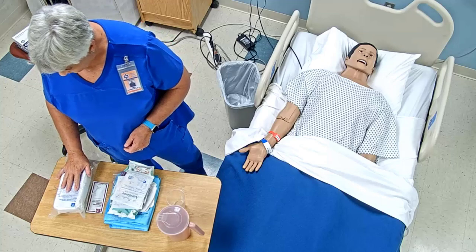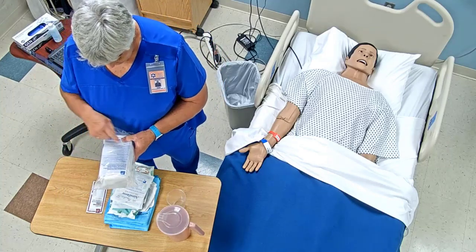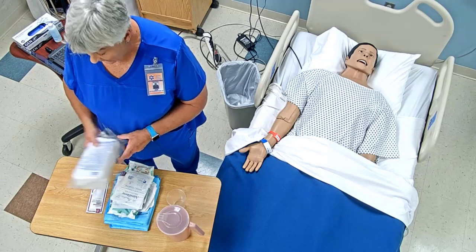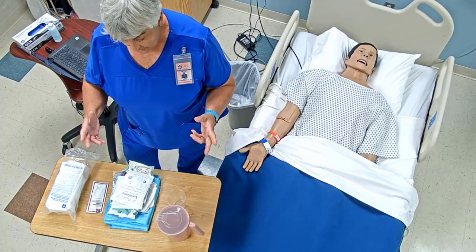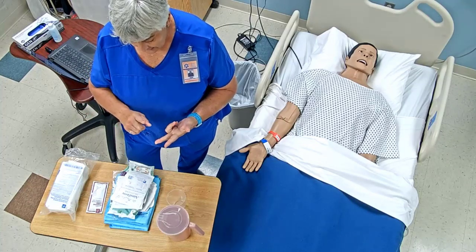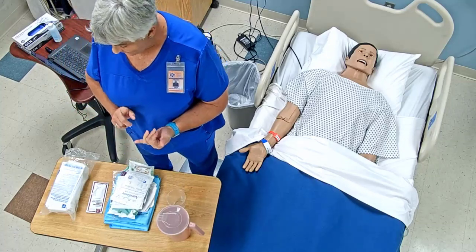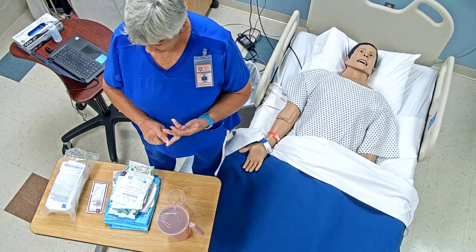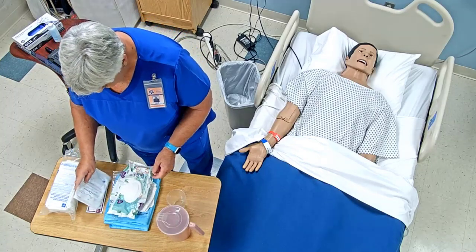So I've identified what's all in my contents, made sure I had everything. Since I'm doing a specimen, it does say it has a specimen container with a lid and label. I would get the lab requisition from the chart, which will have the patient's name and all the identifiers on there. It should have the order on there, but when I take the specimen, I will need to put the date and the time that I did that, and my initials on there. Okay, so we've got that.